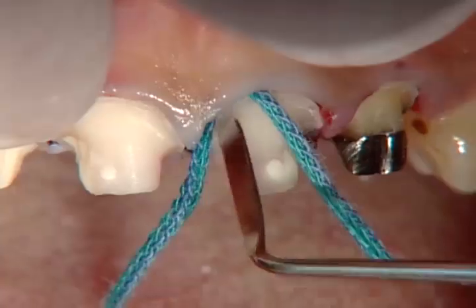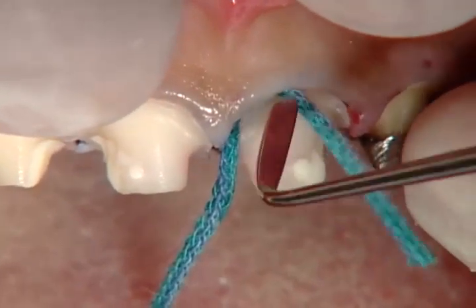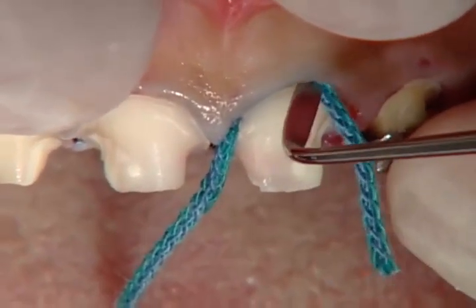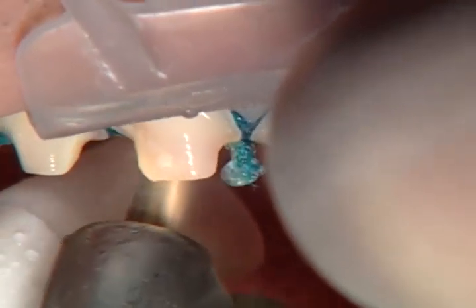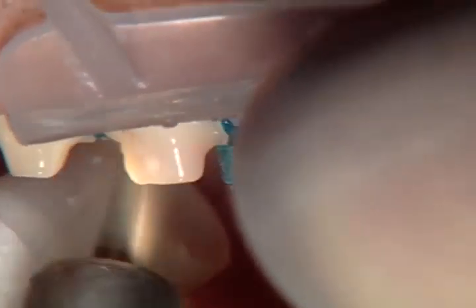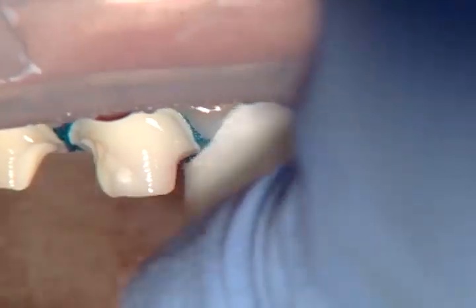We verify once again that the biotemps go into place passively, and now our top cord goes into place. This is a 2E cord from Ultradent, so the 00 cord is still in there, and we're packing this cord on top of it. Every once in a while we'll see a rough spot on a margin or a little jagged edge when we put this cord in, and we'll go with this burr, the 856.025, in a fine version and go smooth that off.